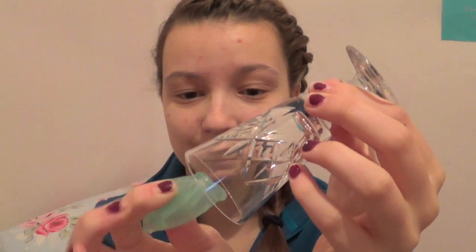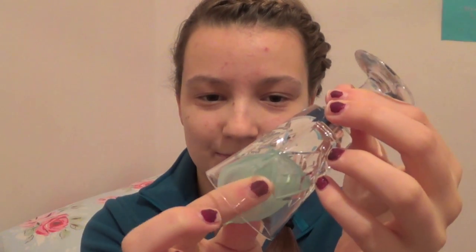Now, the Lady cup is a very firm resistance cup. Nothing stops this cup from opening, so hopefully it should work pretty good in here. Now, of course, I've said that, it's probably not going to do it right. So your vagina is sloped at that sort of angle, going backwards towards your rectum or your large intestine. So you insert your cup in and let it pop open.